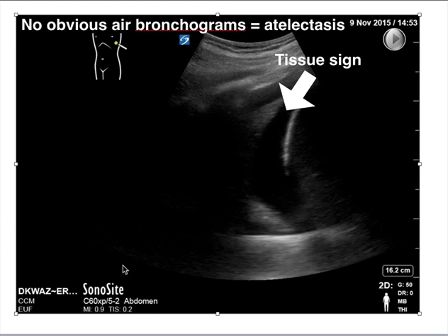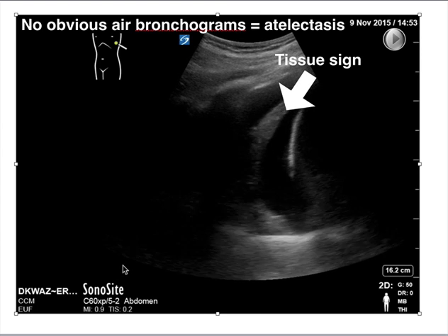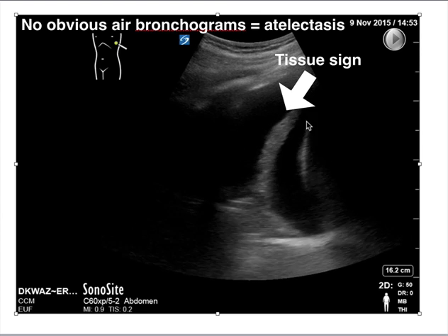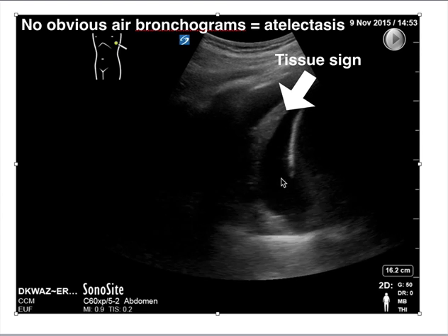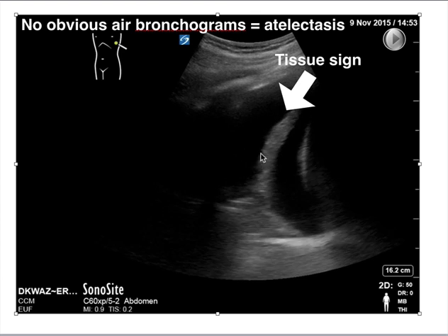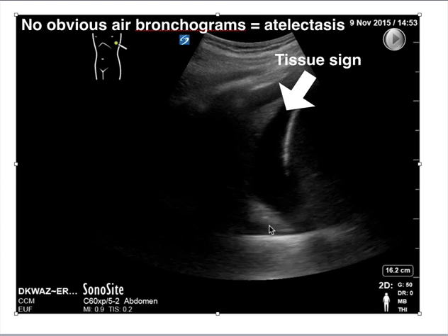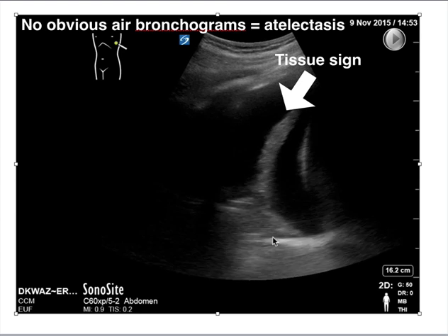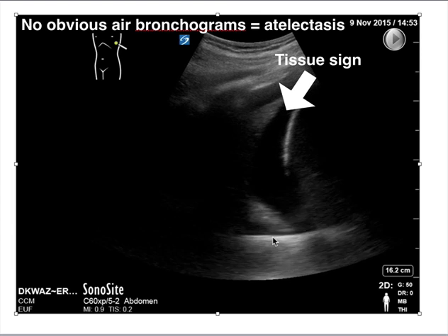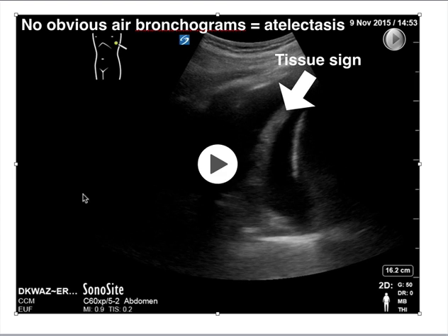In contrast, this next structure has no obvious air bronchograms. Again, you see a moderate pleural effusion and a diaphragm. If you look closely at the lung, it really just looks like a liver — hepatization, or what we call a tissue-like sign. This actually just indicates atelectasis or consolidated lung.